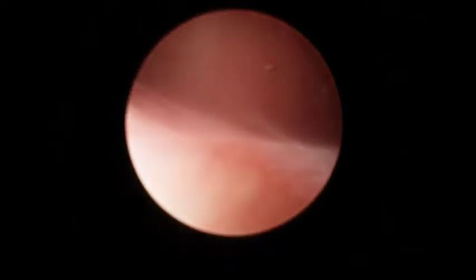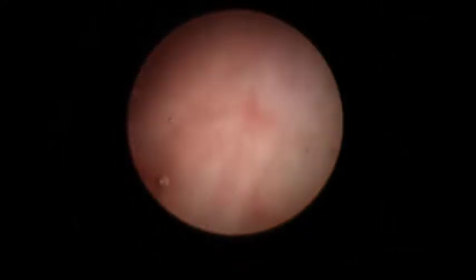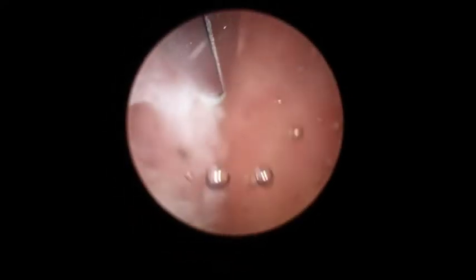A method to improve visualization while using normal saline is the flow-by technique. Here you can see that the operative field has become obstructed with blood and tissue. To improve visualization, the flow-by technique is illustrated: the hysteroscope is brought close to the pathology to let high-flow normal saline pass by the tissue and clear the field.